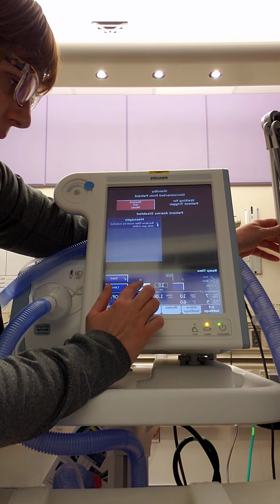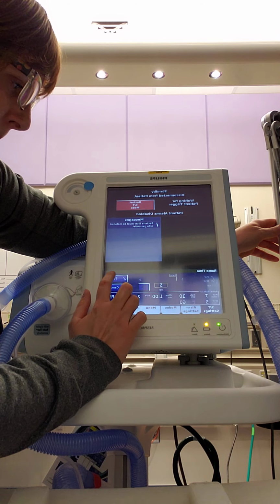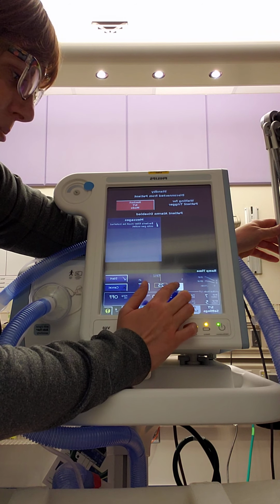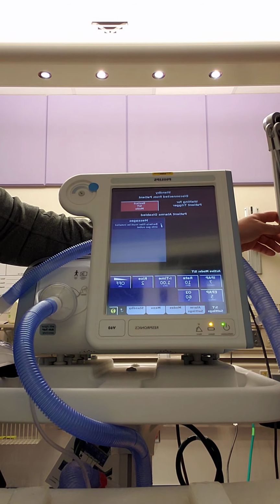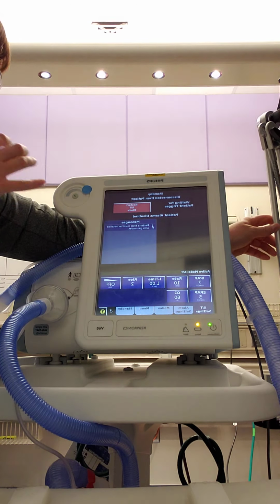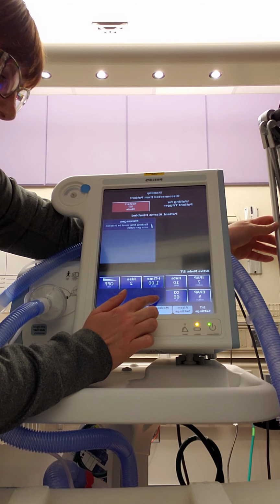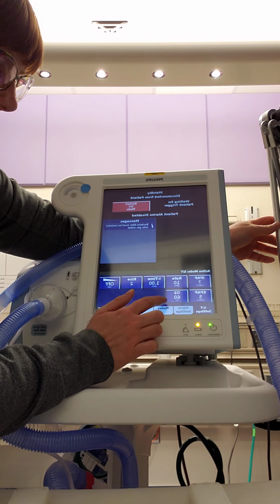This is the ramp. Some facilities have, similar to CPAP, that's how long it takes to reach those set pressures. But if I have a patient in respiratory distress, I'm just going to want that pressure immediately. And then finally over here, we have FiO2, which is our percentage of inspired oxygen.